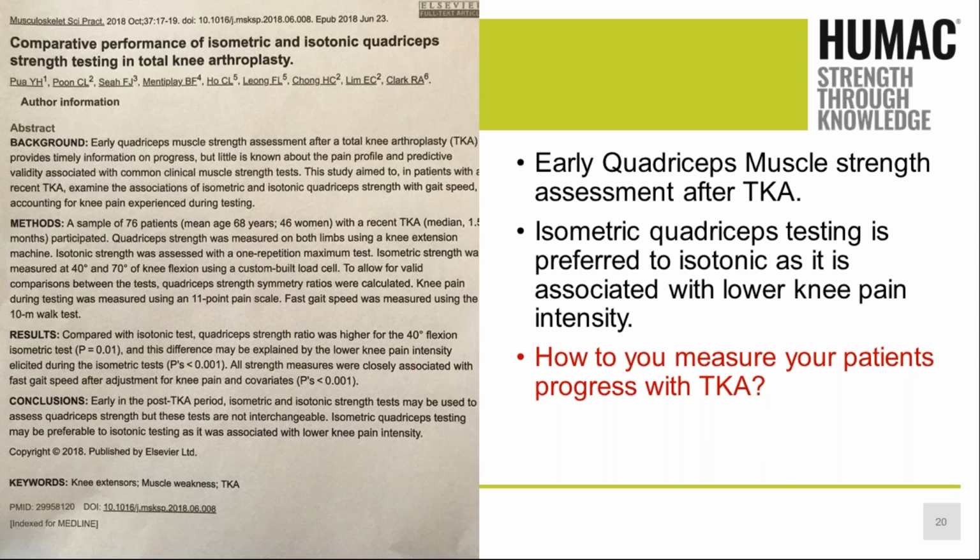And then when we can see that they're doing eccentric loading correctly, we get them into the very gentle quadricep isometric stabilization, starting at 60 degrees and slowly increasing it as we go. What's interesting about this, though, is how do we actually test and measure those patients to progress them with the TKAs? How do you send back that information? Are you saying that, oh, they went from a 3+ to a 4?